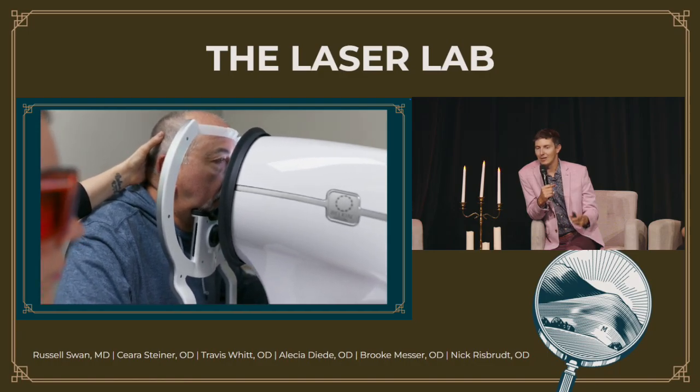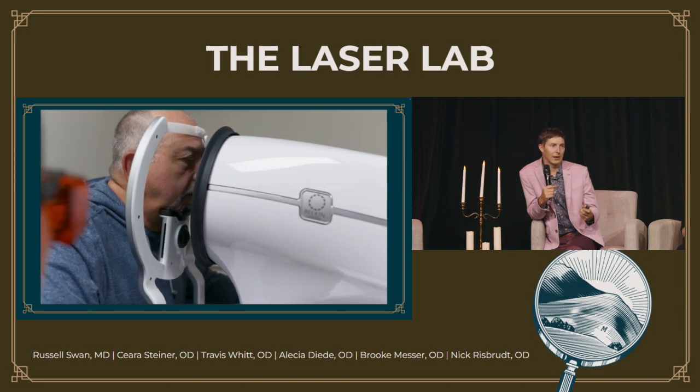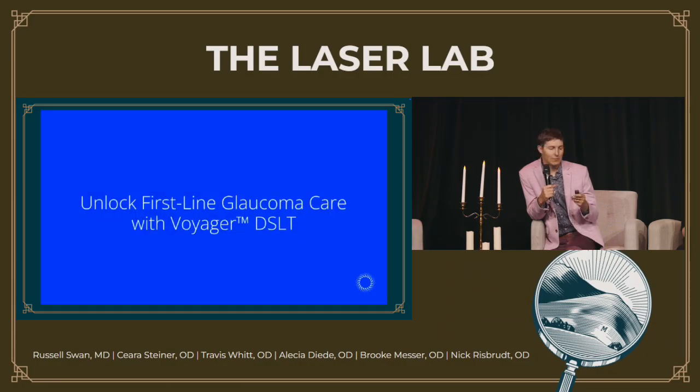So they're turning the lights on. This is the activation of the laser. We are already done. And then it's done. And the patient sits back. So the actual laser treatment itself is just a couple seconds, which is kind of a new fun area.